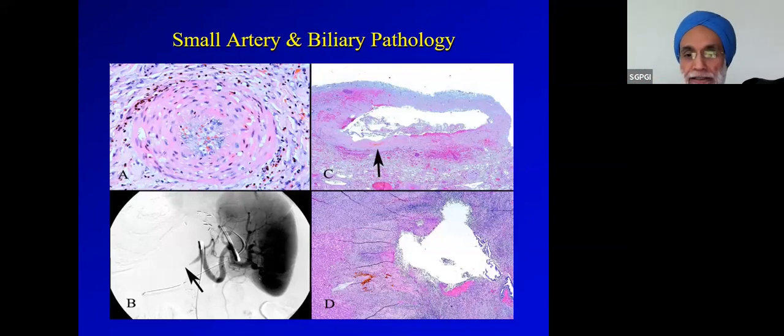And you can see this hemorrhage around the portal vein wall, and this is ulceration and hemorrhage of the common bile duct, and this is a stricture seen on radiology. So this is similar somewhat to the malignant hypertension changes in the kidney. If a vascular system in any organ sees a lot of pressure, that itself triggers a lot of pathology.